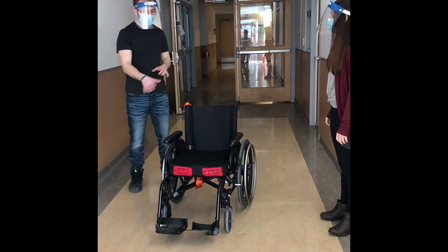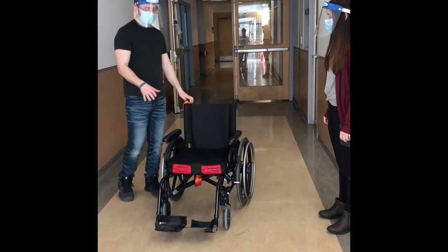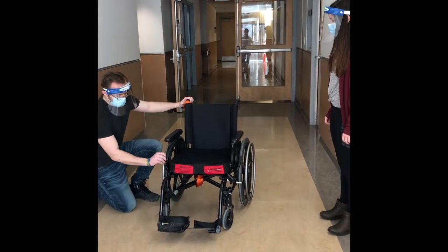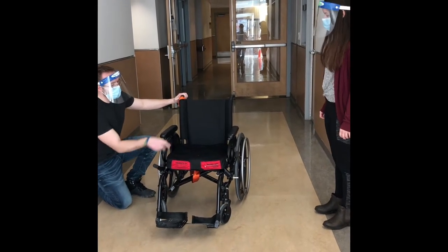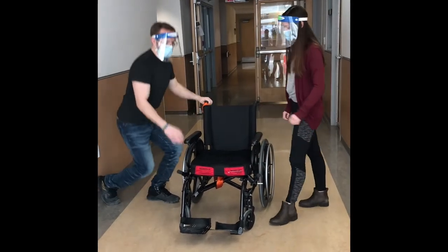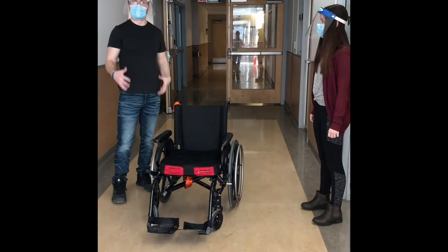Before we start doing any folding or unfolding, we want to make sure the chair is stable. To do that, we're going to make sure the brakes are on. We're going to get down like this and engage the brakes by pushing this forward. You can try that for me. Perfect. So now that it's stable, we can move on to folding and unfolding the chair.